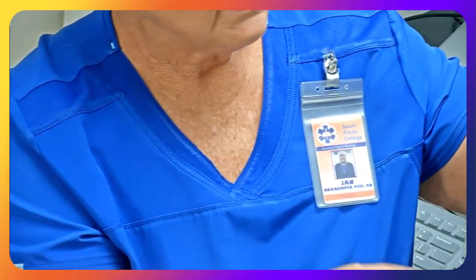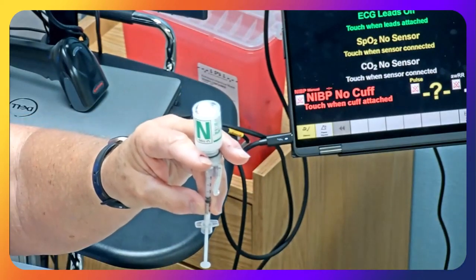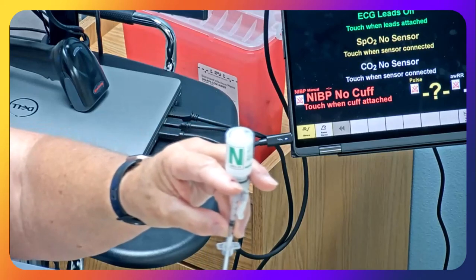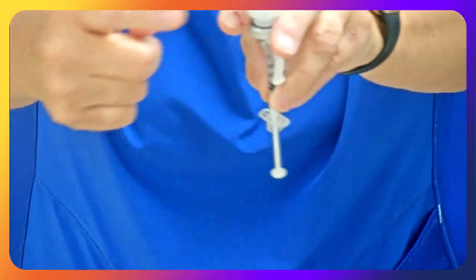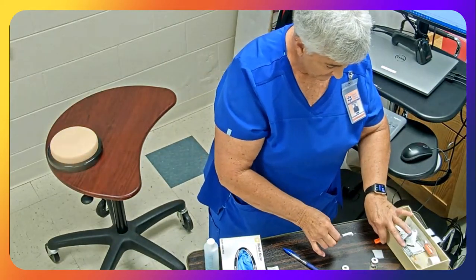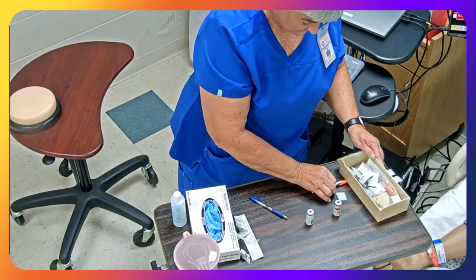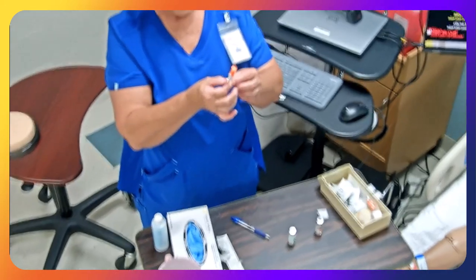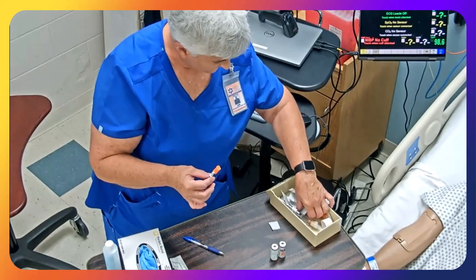So now, again, I'm going to have my licensed personnel tell me what they see. They see NPH insulin and they see 20 units, okay? That's correct. That means I did my math correctly, because we did 8 and then we did 12, which gives us our 20. I'm going to ask my second licensed personnel, what do you see? They say NPH insulin 20. Again, that tells me that I got the correct amount. And so very carefully, without touching, I'm going to go ahead and recap my needle, okay? And making sure I still have my 20. And now I need to label.